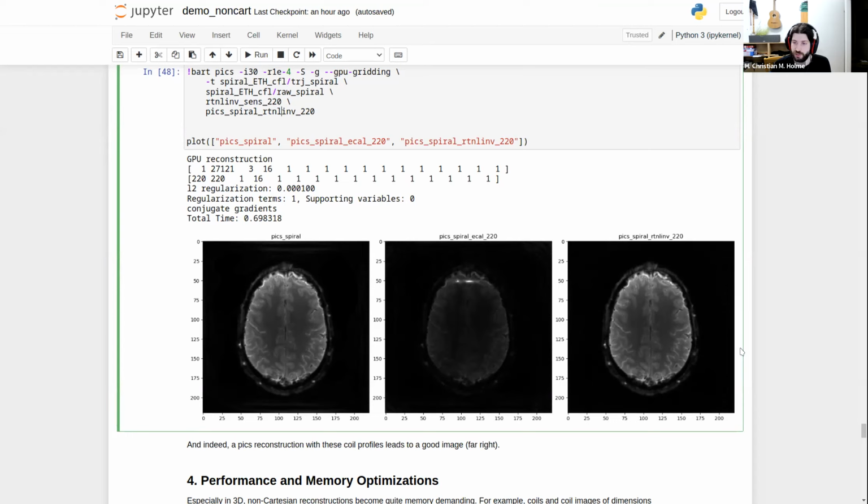And with that, that is how much I wanted to say. Question is there: you could also, correct me if I'm wrong, take the low resolution image you reconstructed, 0 pad that, and then compute the maps with E-spirit. Not quite sure what you mean.